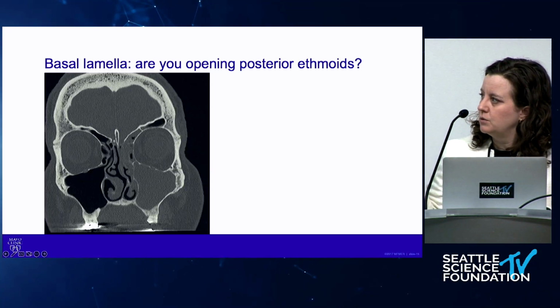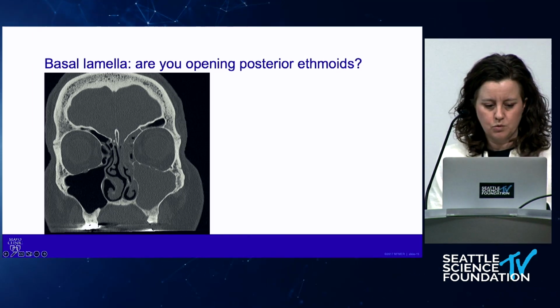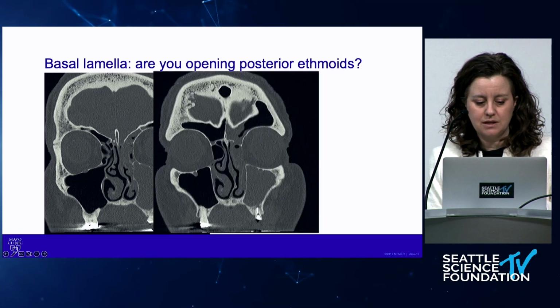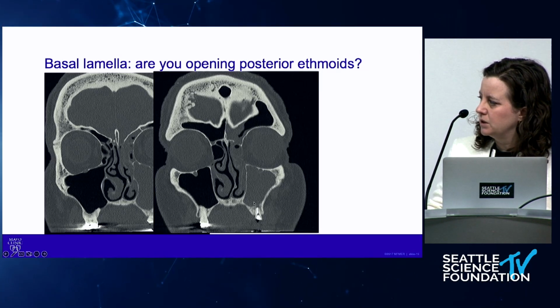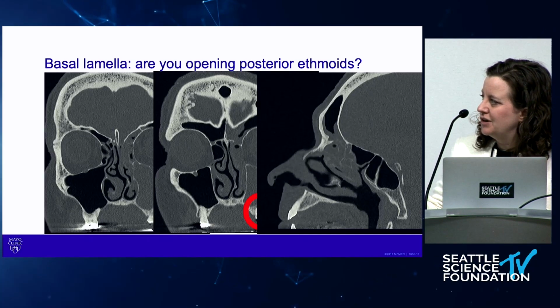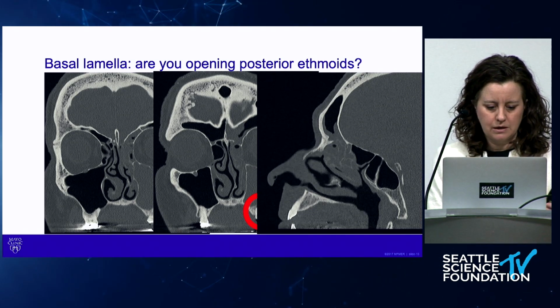This comes back to how much ethmoid disease. The basal lamella is that boundary between the anterior and posterior ethmoids. This is a gentleman who on a coronal view has frontal, anterior ethmoid, and maxillary sinus disease, and here's the culprit. This bad tooth, periapical disease, already had a filling, but the tooth is bad and has disease from the maxillary sinus extending up into the anterior ethmoids and the frontal. Odontogenic sinusitis generally does not go through the basal lamella. So this gentleman's surgery is only anterior ethmoids. And sometimes if you see on a sagittal that it doesn't go into the posterior ethmoids, look at the teeth, because a lot of times that's the pattern for odontogenic.